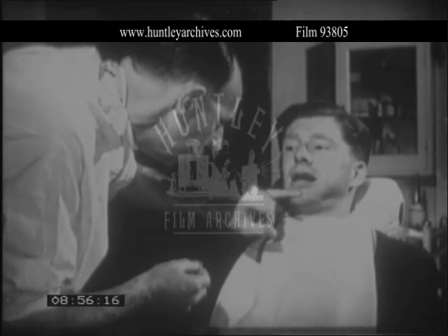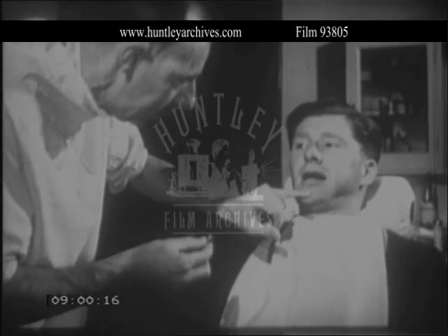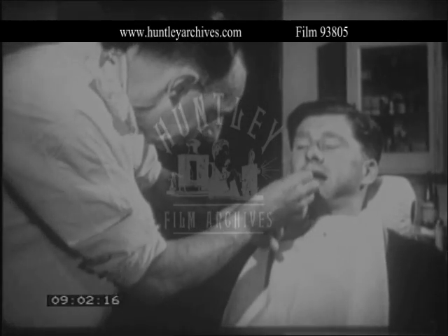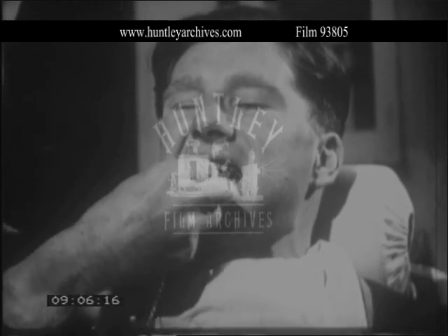A patient with an acute abscess on a lower molar tooth may be able to open his mouth a quarter of an inch only, due to spasm of the masseter muscle. Before anesthesia, place a baby-size prop on one or other side of the mouth.